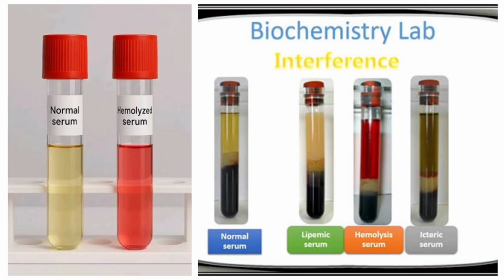If the sample is hemolyzed, or has high bilirubin, or icterus, as a biomedical scientist, you have to use scientific judgment to check that the hemolysis or high bilirubin or high lipid has not negatively impacted the result you want to release, even though the result is within linearity.